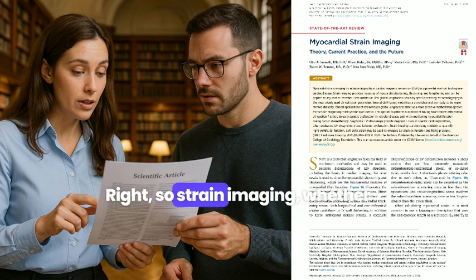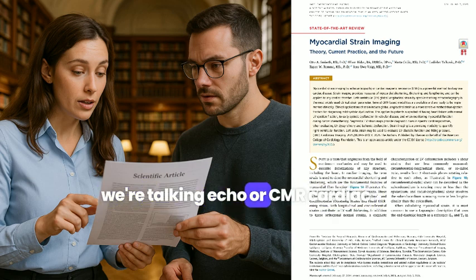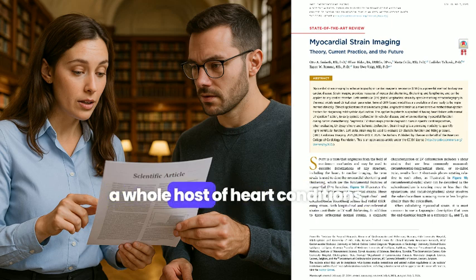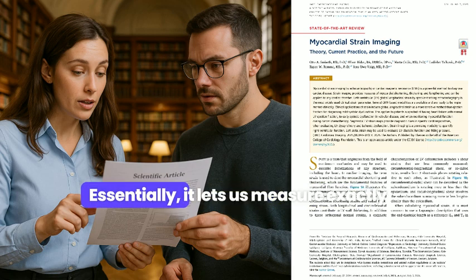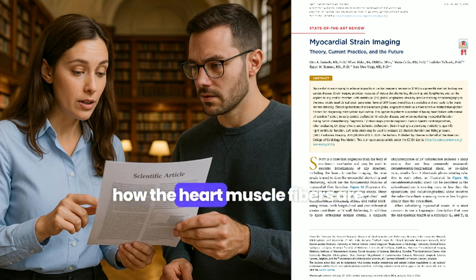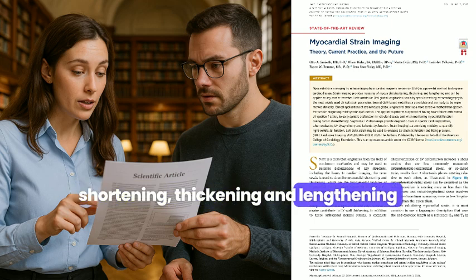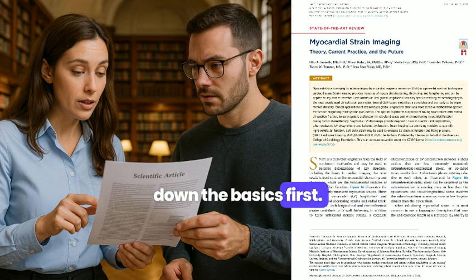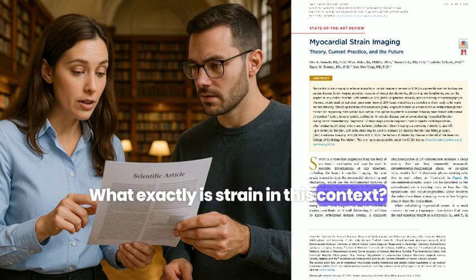Right. So strain imaging, whether we're talking echo or CMR, cardiac MR, it's fundamental for diagnosing a whole host of heart conditions. Essentially, it lets us measure exactly how the heart muscle fibers are shortening, thickening, and lengthening, in all four chambers as the heart beats. Okay, let's just nail down the basics first. What exactly is strain in this context?